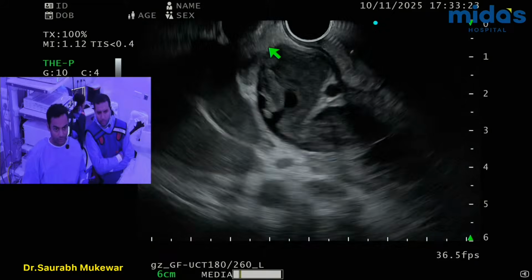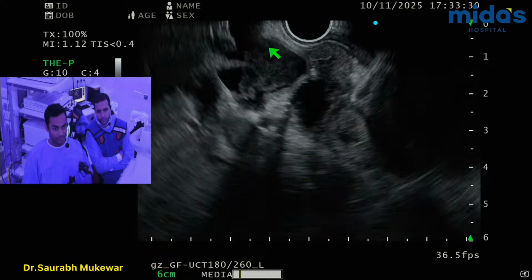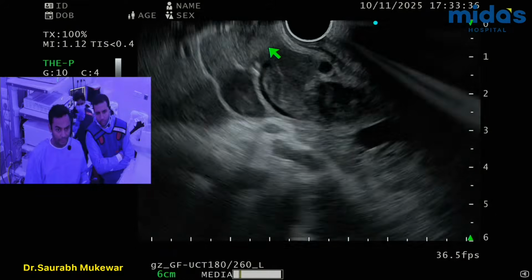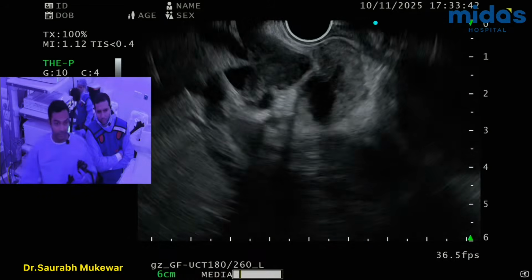The other option is to go up here, above all this jazz, and then this is sort of where it enters into the intrahepatics. So what we may do is maybe hit here, and then it still is an angle actually. It's not going to be that easy from there as well.